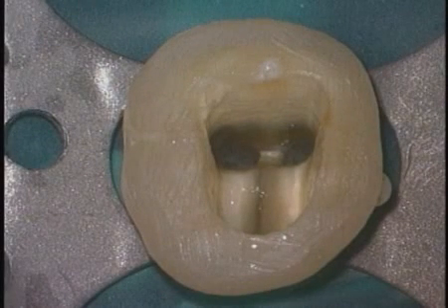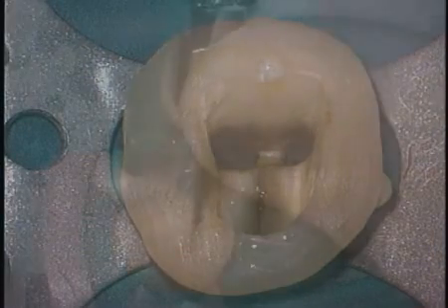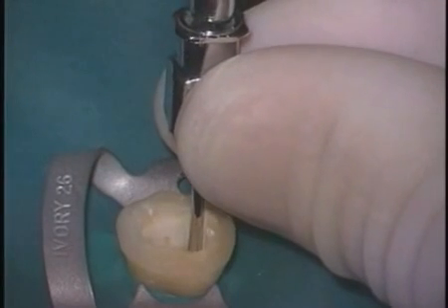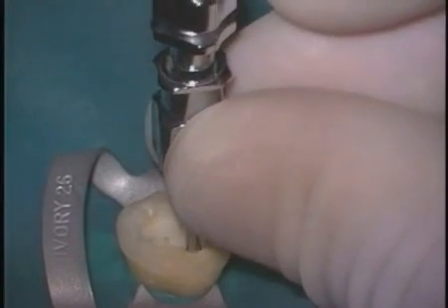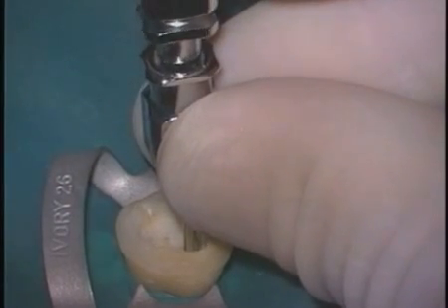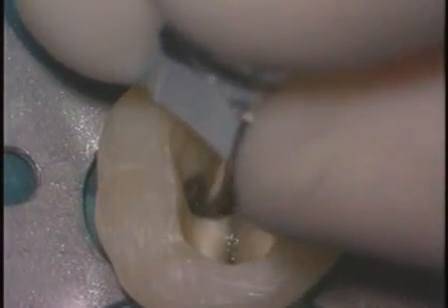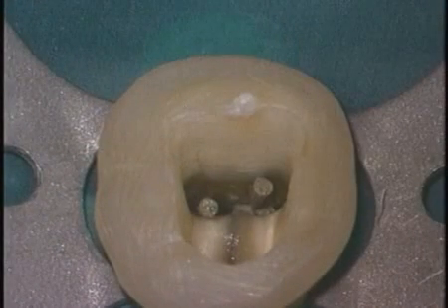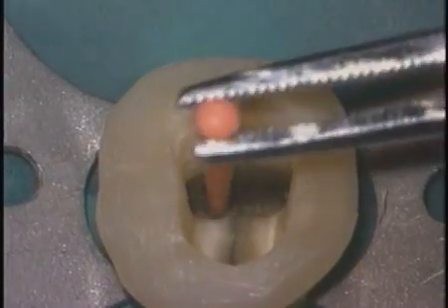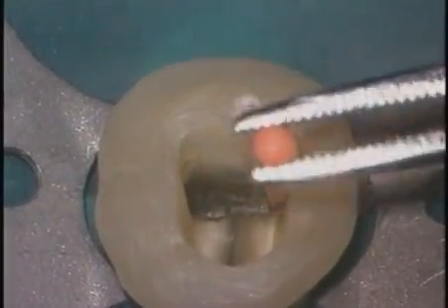Once the canal has been fully prepared, coronal to the defect, MTA may then be carried into the field. The modified spinal tap needle can be introduced into the chamber and specifically into the canal system that we're addressing. A very simple move of the index finger can place the material precisely. Once the material is in there, we can use a flexible gutta-percha plugger and we can begin to shepherd the MTA into the narrowing cross-sectional diameters.